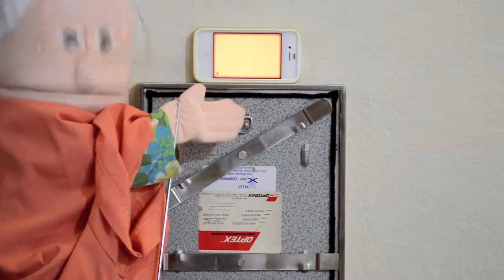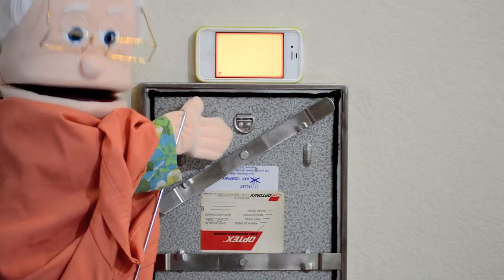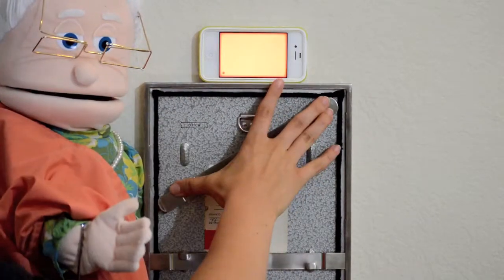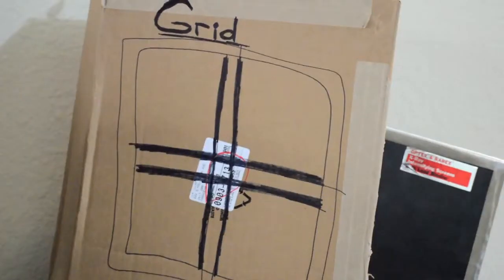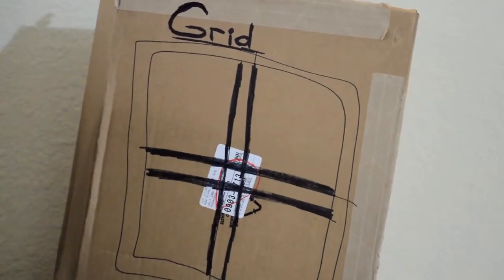Now let's put it to practice. I'm in my dark room with my red filter on. I insert my film into the cassette and secure the back to make sure no light can get in. I place my cassette in the grid, which also helps further reduce scatter to improve image contrast.